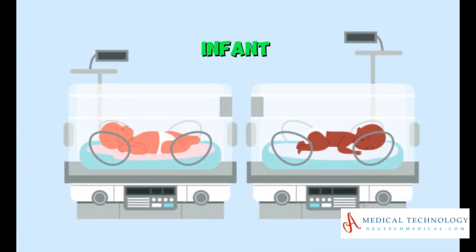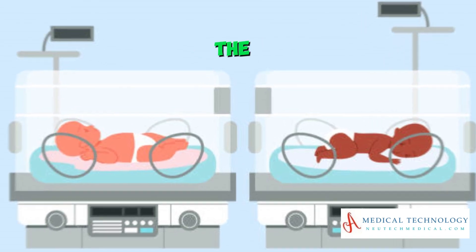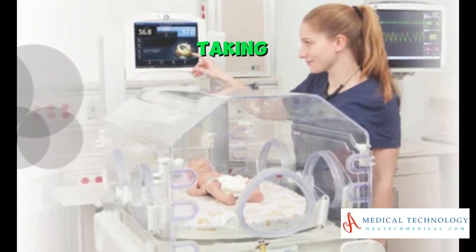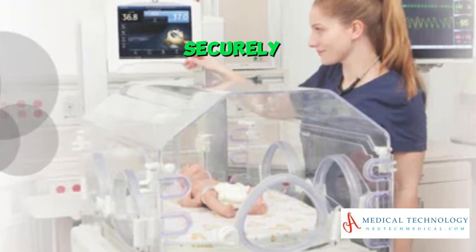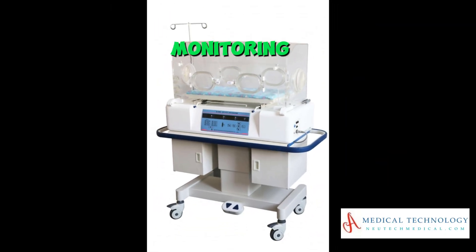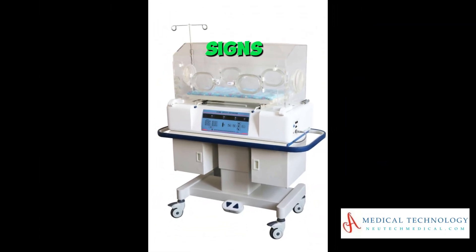Placing the infant inside: Gently place the baby in the incubator, taking care to position them comfortably and securely. Connect any necessary monitoring devices to track vital signs.